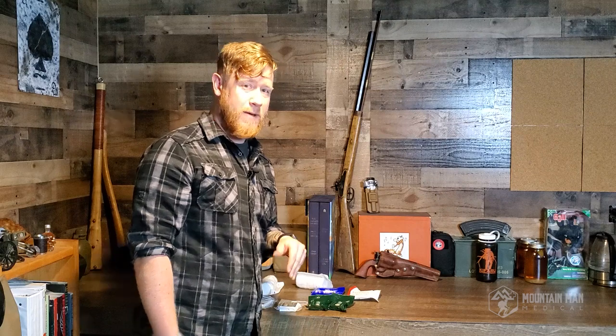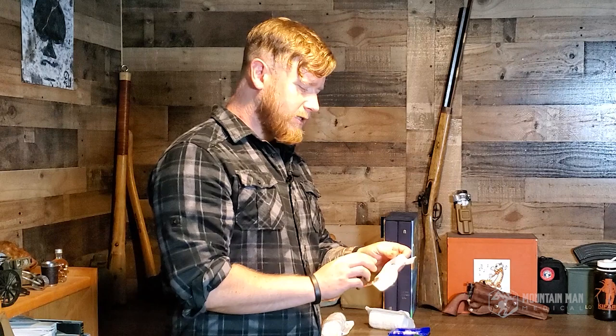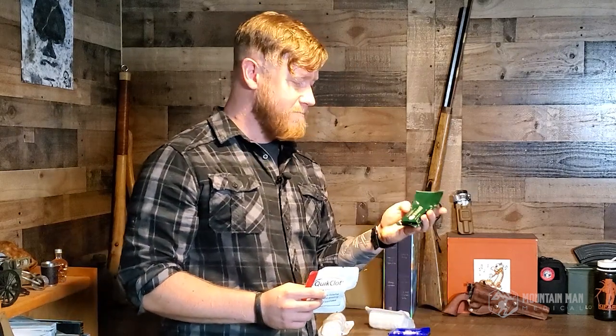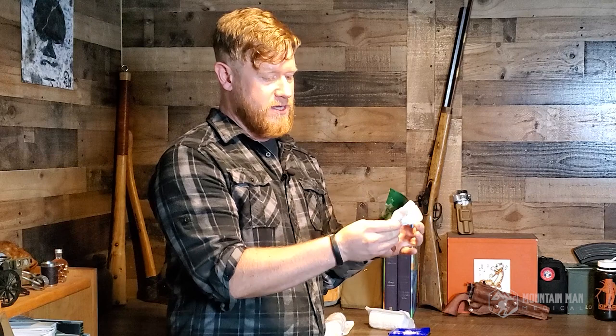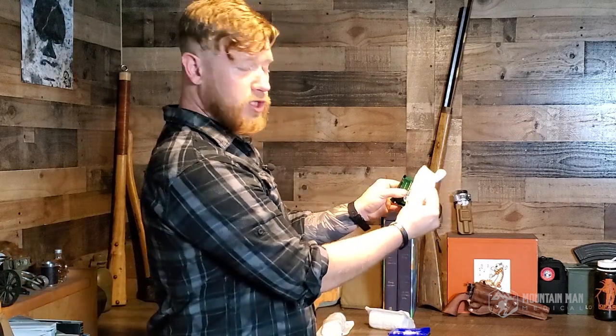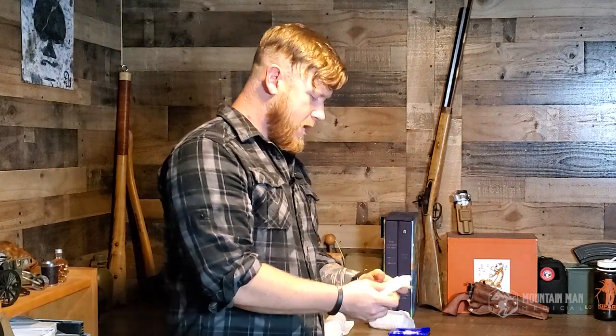What some of you might be wondering about is why isn't he talking about quick clot gauze? I'm getting to that next. The quick clot gauze is a very good way of helping to control the bleeding. It works exactly the same as this compressed gauze. In fact, it's packaged almost completely the same. If you were to fold in all these little wings, it's pretty comparable in size to the Dynarex.